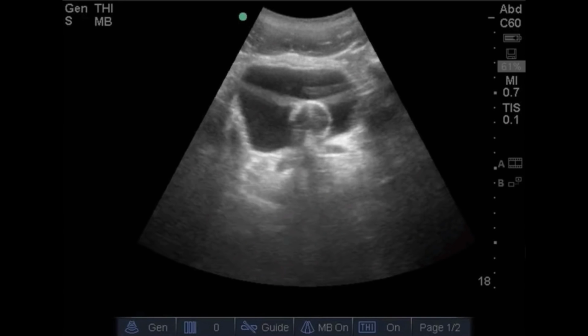Reverberation artifacts occur when sound travels into tissue. Because of high reflection, the sound bounces within that tissue and returns multiple signals to the probe. Because the probe assumes that ultrasound has traveled only in a single line, those reflections and reverberations are then mapped in increasing depth throughout the image. You can see here the reverberation line passing through the bladder, and you can see that it does cross anatomic boundaries, leading you to the assumption that it is an artifact. It is a reflection of the probe bouncing off the peritoneum on the anterior surface of the bladder.